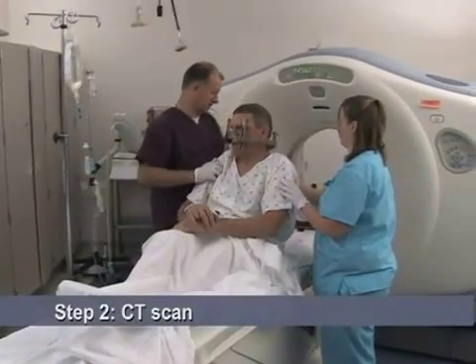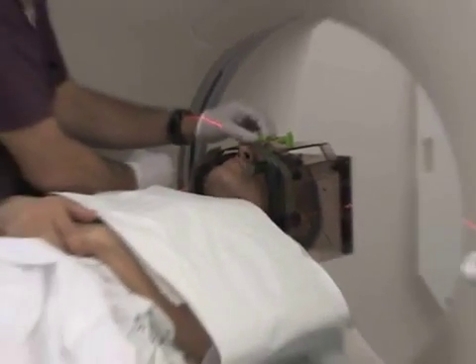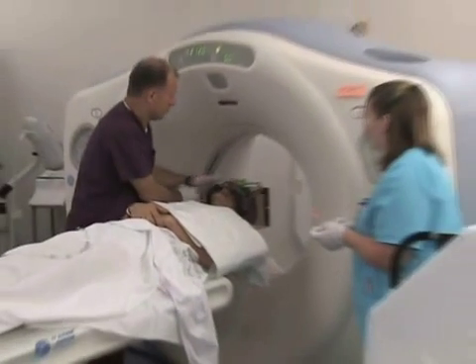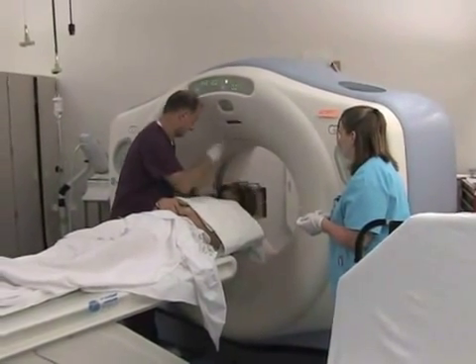Next, you will have a CT scan taken of your brain. A box-shaped device is placed over the top of the frame. Markers in the box show up on the scans and help pinpoint the exact location of the target area within the brain.